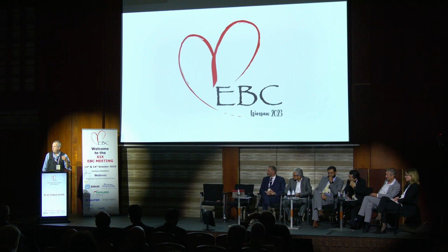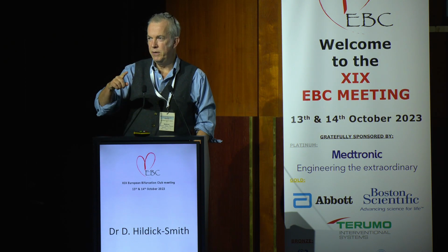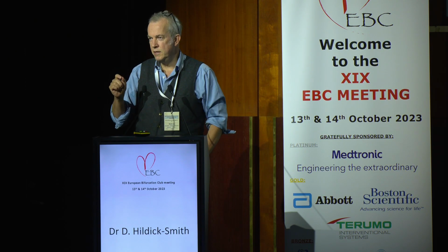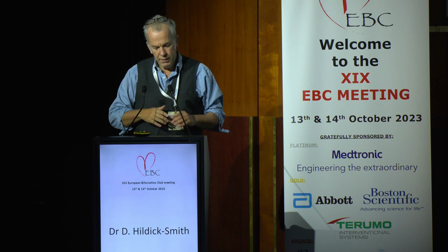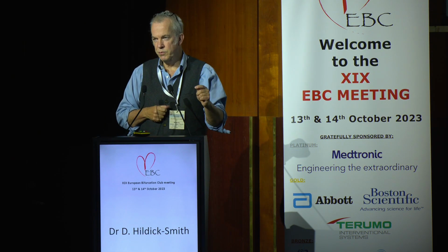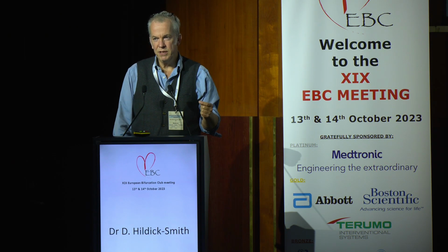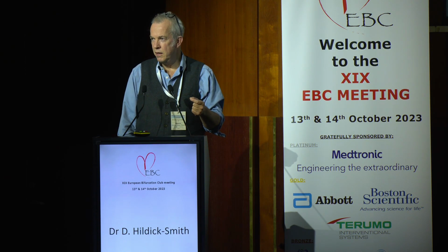But for me, and clearly for some people who've been doing this for many years successfully, quietly, there's a nagging doubt. And that is that although stents are great, and there are certain circumstances, a bit like the one shown on an angiogram recently, where a stent is definitely a go-to therapy, nonetheless there are problems with stents. It's not a free hit. Once you implant a stent, you can't take it out. And there is a price to be paid for that stent.